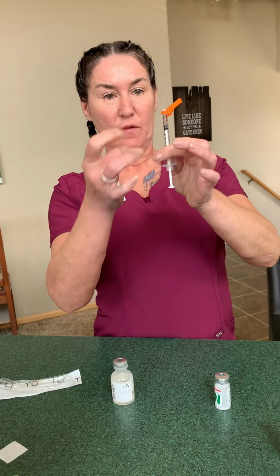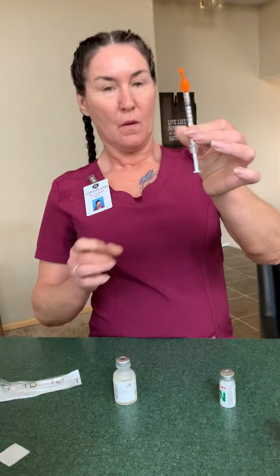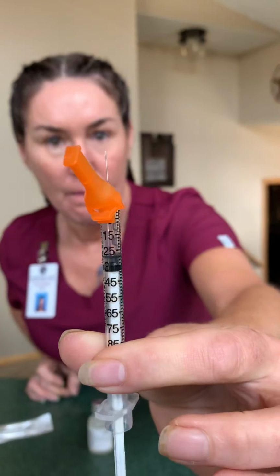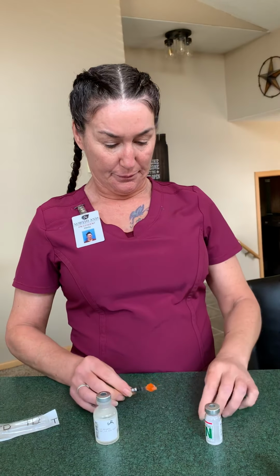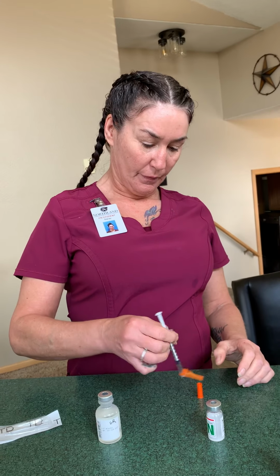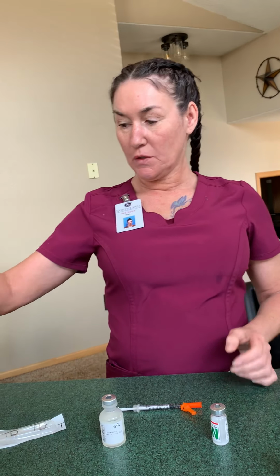You're going to want to remove any air bubbles, and then show that we have no air bubbles in our needle. I'm going to recap our needle for safety purposes as I get my gloves on to go to my patient.